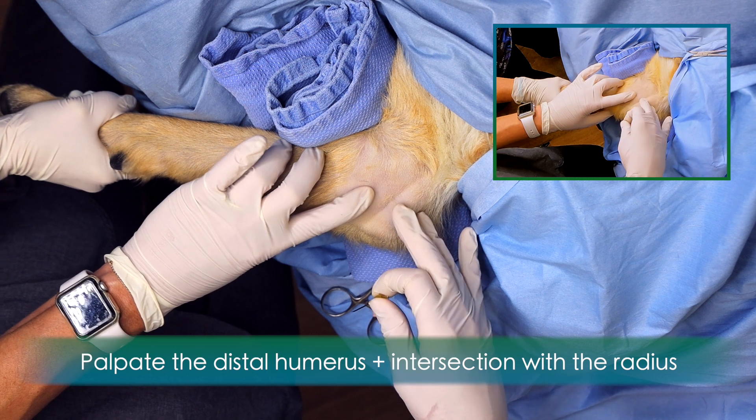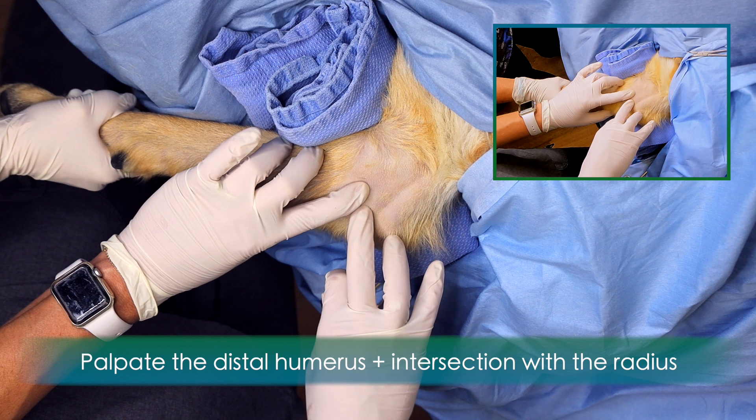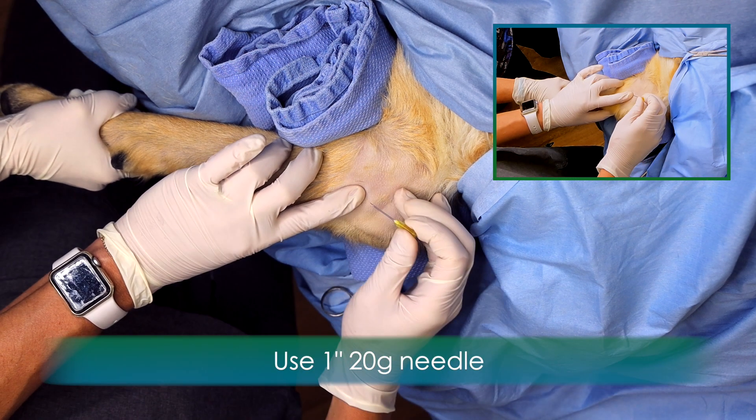Palpate the distal humerus as it intersects with the ulna and the radius. Use a 1-inch, 20-gauge needle to penetrate the joint straight, medial to lateral.